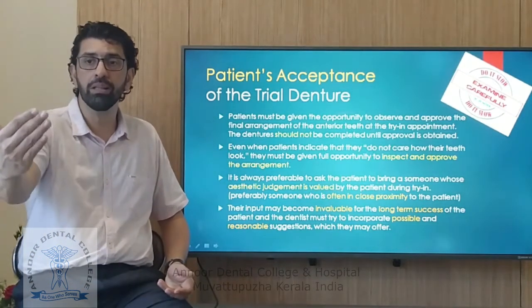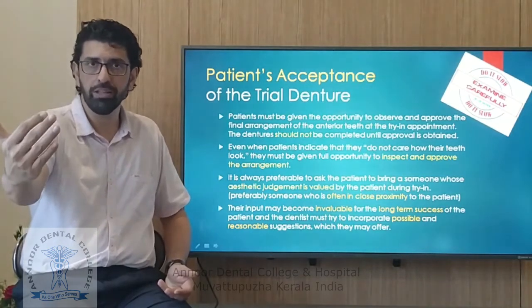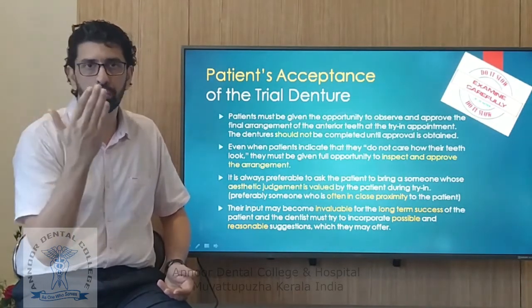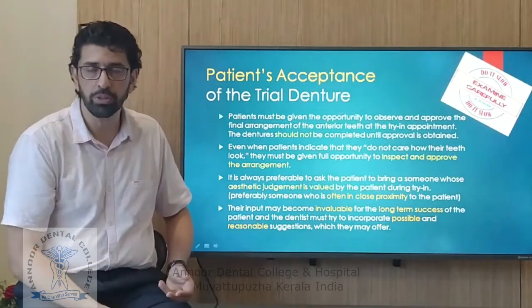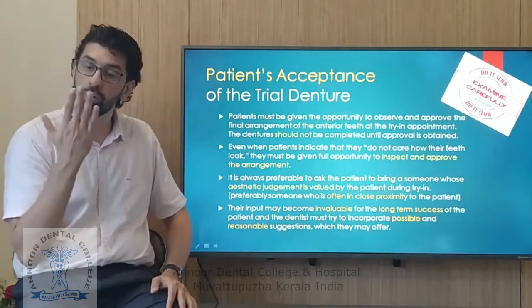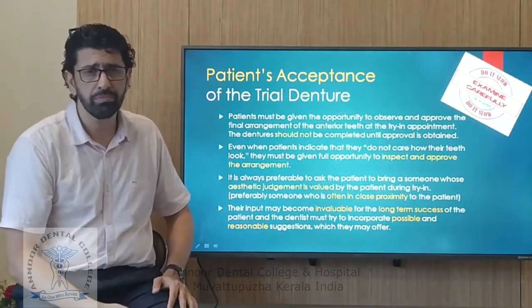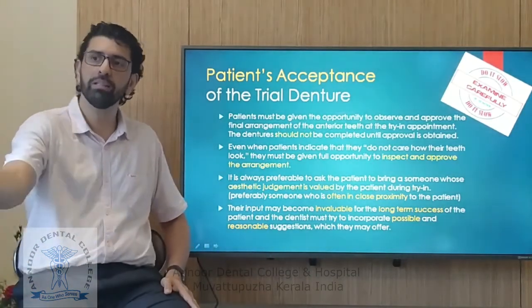Usually you can tell them that we look at each other from about 4 feet or meters distance. Nobody's really going to come in and look at it from very close proximity. You can tell the patient that, but patients oftentimes like to take the mirror and look at it very closely. So I don't think we need to completely restrict them from doing that. Make them aware that this is how people see it.